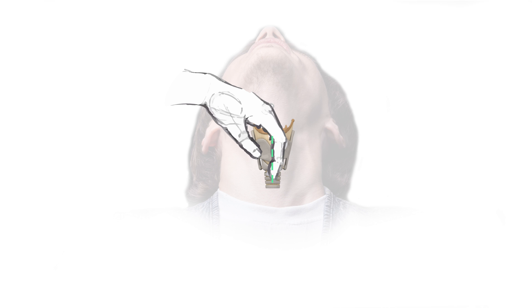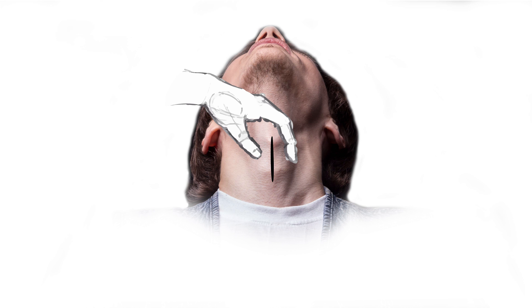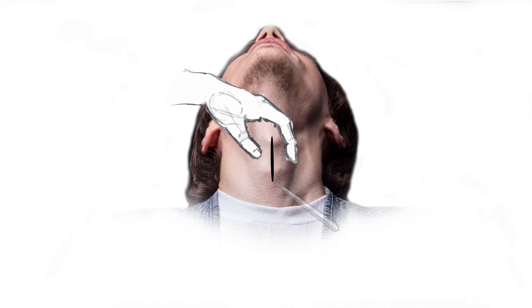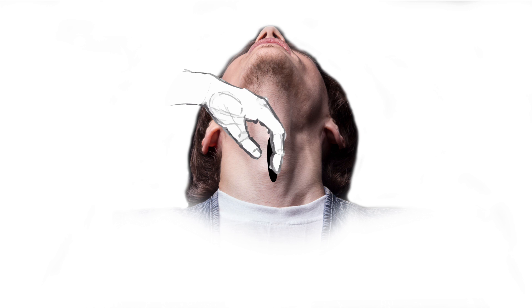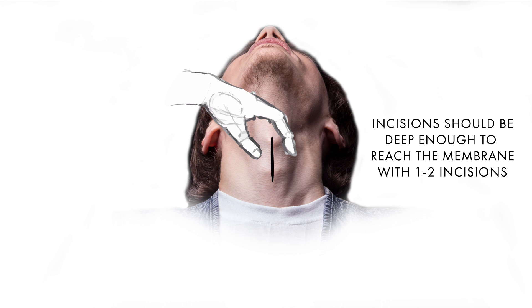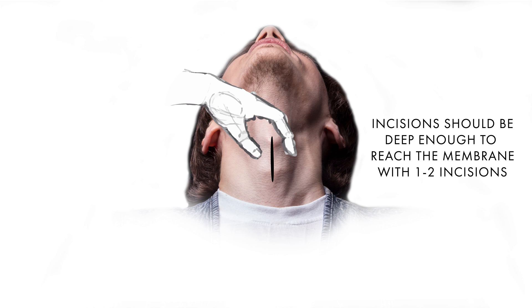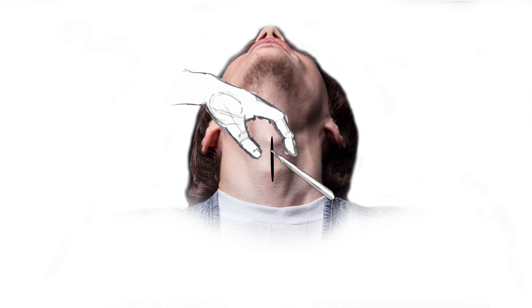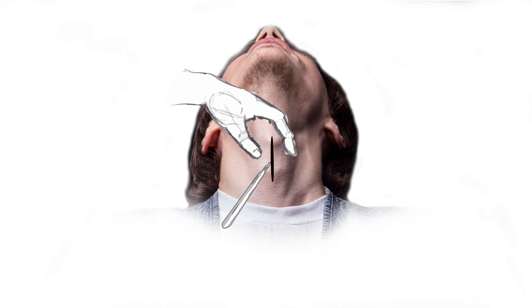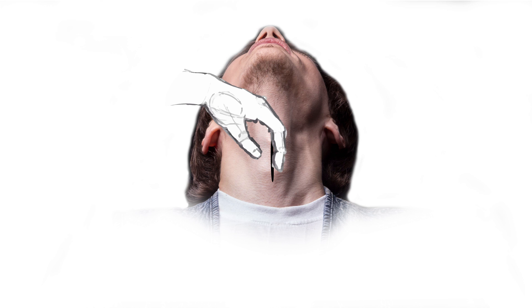When you're ready to cut, hold the lateral edges of the larynx so that when you cut through the skin and soft tissues, the larynx stays midline and does not shift underneath the soft tissues when you make your first incision. After each incision, palpate feeling for the cricothyroid membrane — you may need to cut a little deeper each time. Keep in mind, this is not a delicate, gentle incision. Your incisions should be deep enough so that you can palpate the cricothyroid membrane after one to two incisions. Once through the soft tissue, rotate the scalpel 90 degrees and use it to puncture through the cricothyroid membrane, making small horizontal incisions across the membrane enough to fit your finger between the thyroid and cricoid cartilage and into the airway.